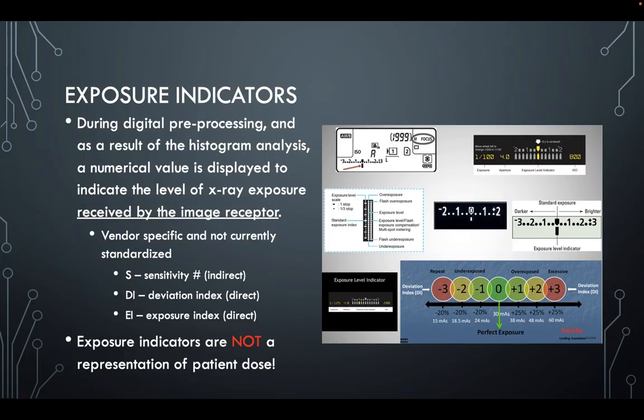Exposure indicators happen during pre-processing, and they are a result of the histogram analysis. It's a numerical value that indicates the level of exposure received by the image receptor.